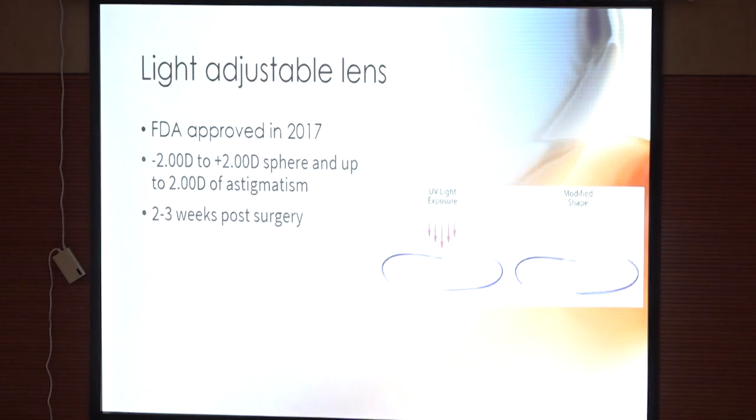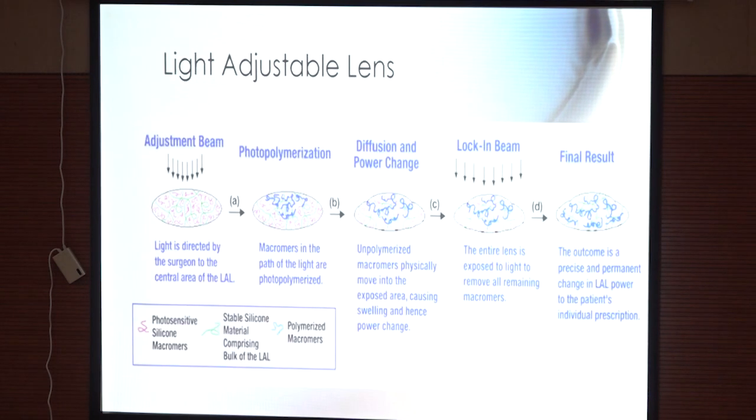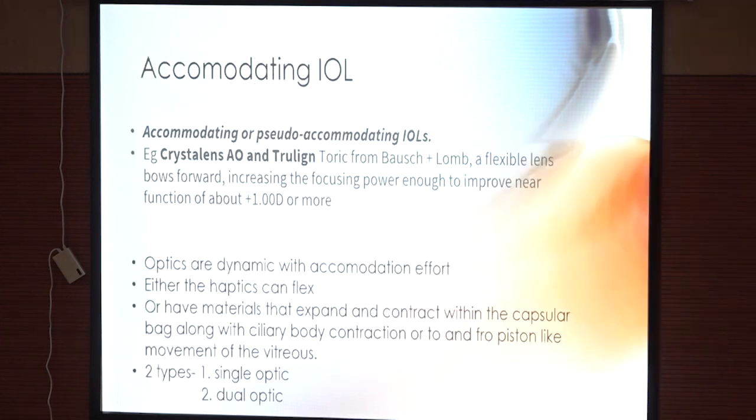And we have the light adjustable lens, which was FDA approved in 2017, not in India right now. So 2 to 3 weeks post surgery, the IOL power can be changed. This is the light adjustable lens, so it has photosensitive silicon macromers.